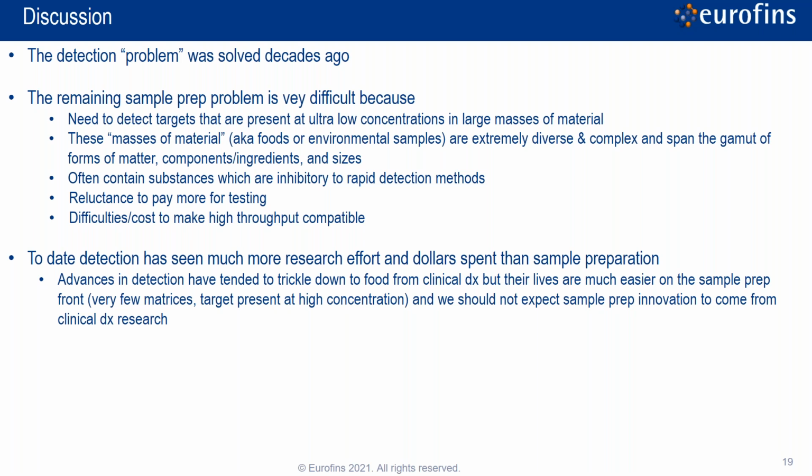You've seen, and I think you're still seeing to some extent, more research dollars spent on detection than sample preparation. And advances in detection have come in the past from the clinical world or the biothreat world. But from the clinical perspective, their lives are way easier in terms of sample prep. They have a few matrices, and targets are present at high concentrations.